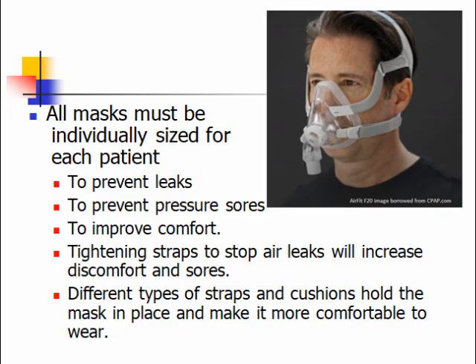We also want to prevent pressure sores. The mask should not be tightened onto the face so that it would be just uncomfortable. The different size masks improve the comfort, and make it more likely someone is going to use their CPAP device.